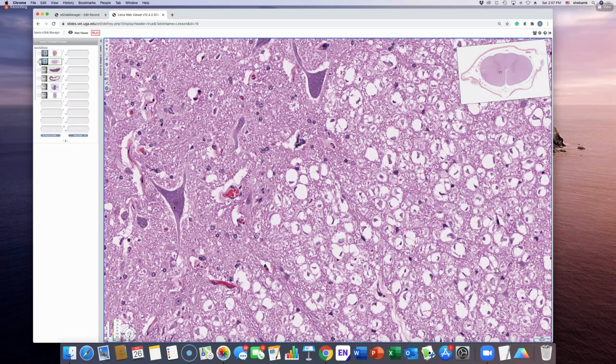What is this blue stuff? Oh, that is Nissl substance. What is it actually? Ribosomes. Okay, so this is a very active cell. And it has these processes. What are these processes called? Dendrites. And then there is this process. That should be an axon, I'm going to call that an axon. Why? Because it doesn't have any Nissl substance.